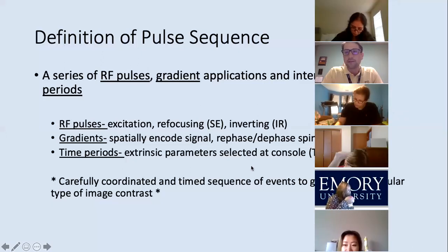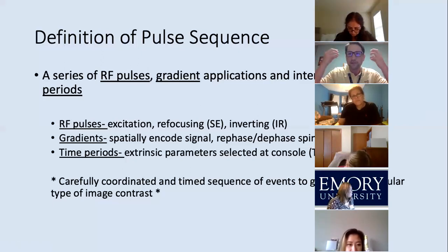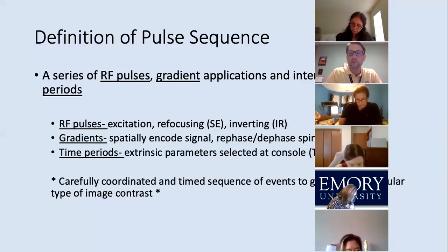But there are other things. You've got diffusion weighted imaging and perfusion weighted imaging, where you're imaging so rapidly that you're able to see the functioning of that brain. You're able to see blood flow go into the capillaries for perfusion. You're able to see water molecules diffusing throughout those macro and micro molecules. So you're able to see functioning physiology. So you have to image very fast. So those are some of the uses of gradient echo pulse sequences.